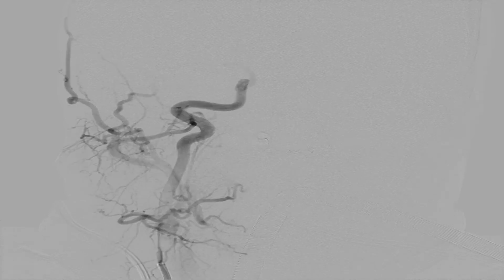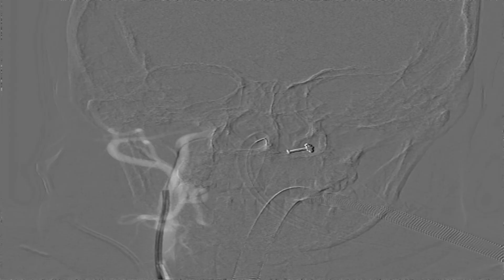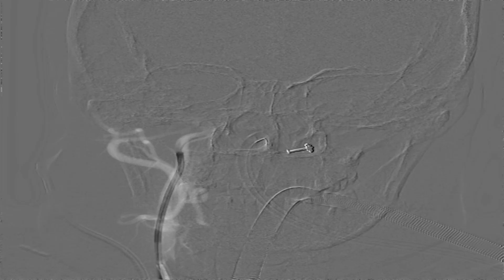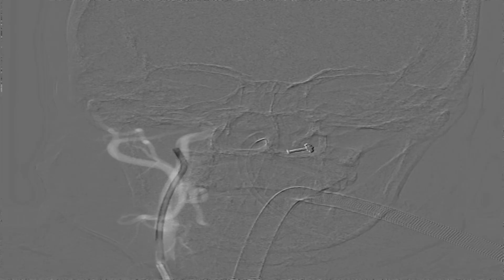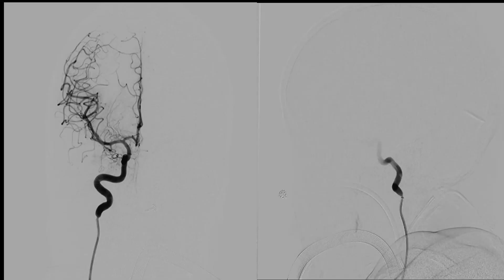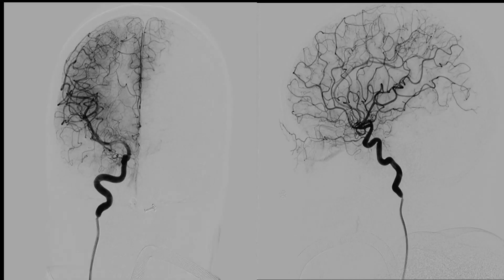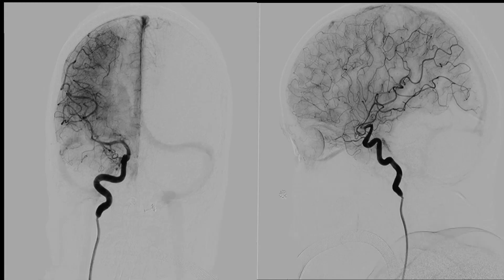From the common carotid artery we take a DSA to obtain a roadmap for the internal carotid artery. We then advance the wire into the internal carotid artery and introduce the catheter over the wire into the right internal carotid artery. We do not need to advance the catheter beyond the cervical portion of the internal carotid artery for diagnostic DSA. From here we take biplane DSA until the delayed venous phase, and a 3D angiogram.